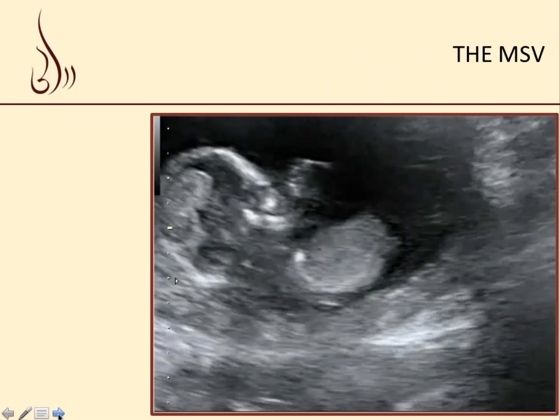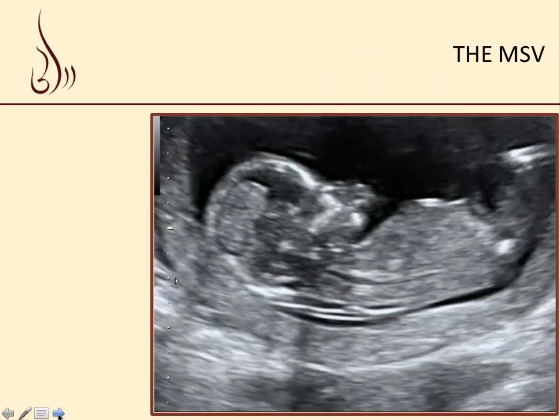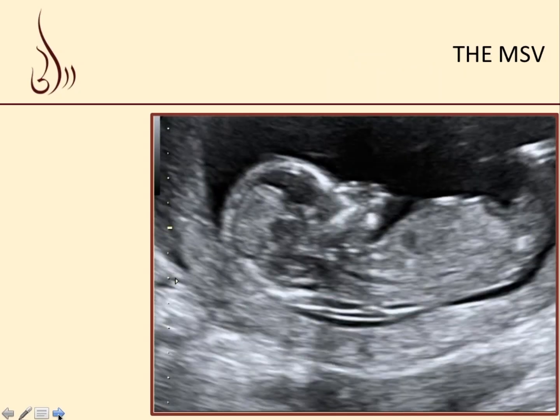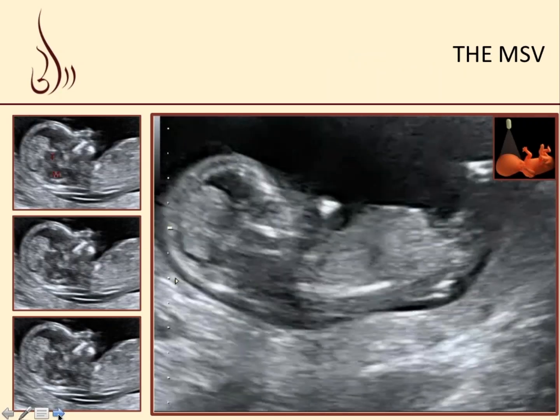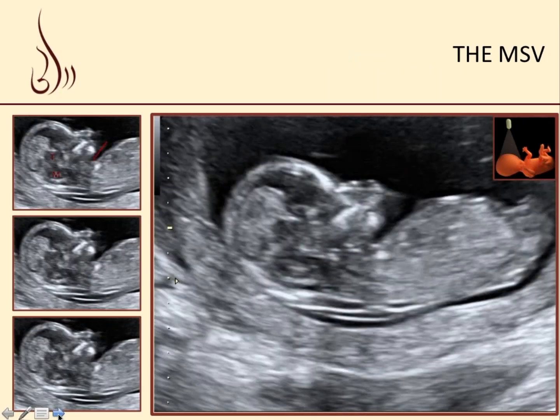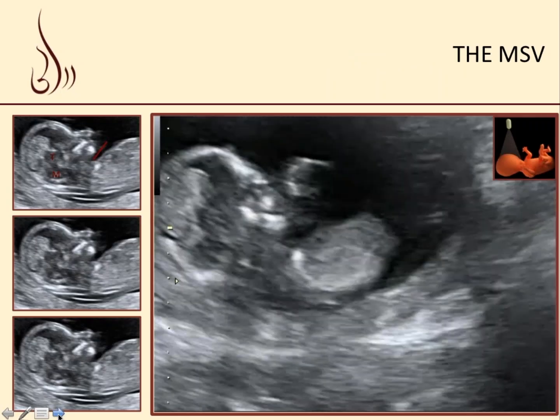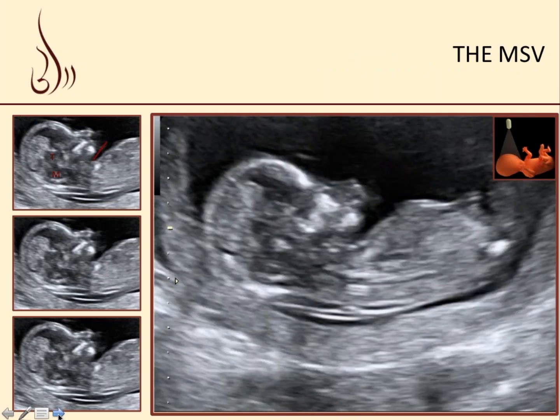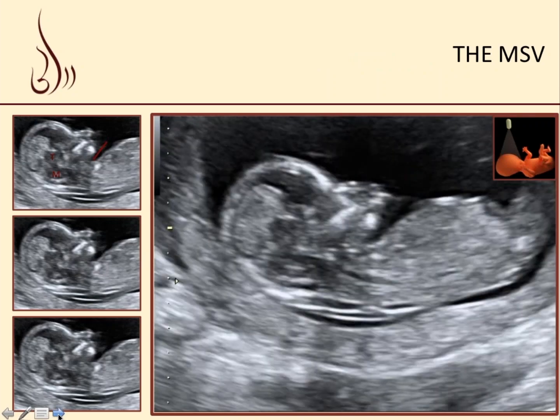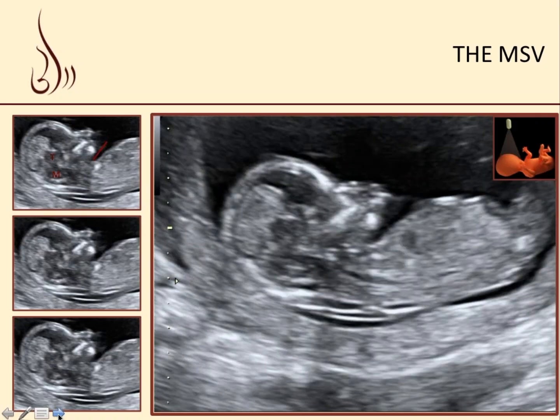As we are scanning the fetus and we are trying to obtain this view, we try to see these landmarks, the thalamus, as I mentioned, and the midbrain. We need to make sure that the fetal neck is neither flexed nor extended, but it is in a neutral position. Your ultrasound beam is perpendicular to the fetus, and in the cine, magnification is not maximized, but again, when you freeze the image, this would be very important.